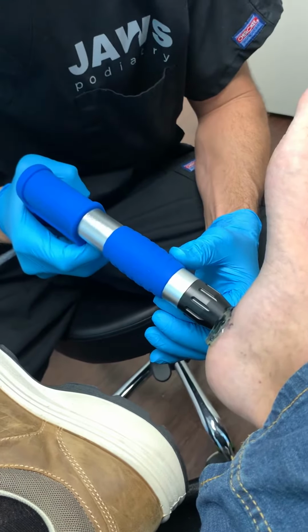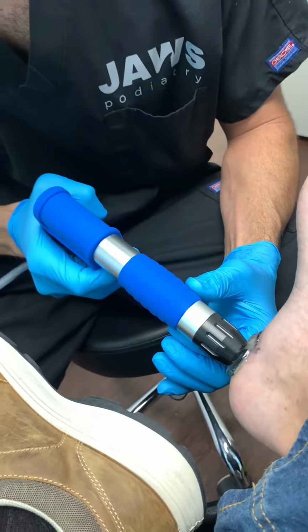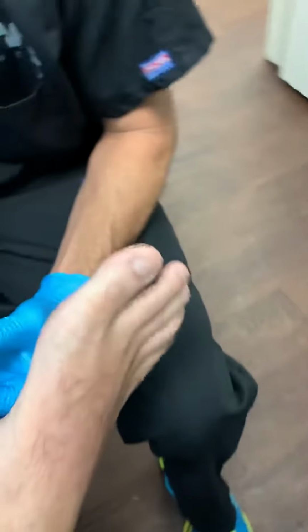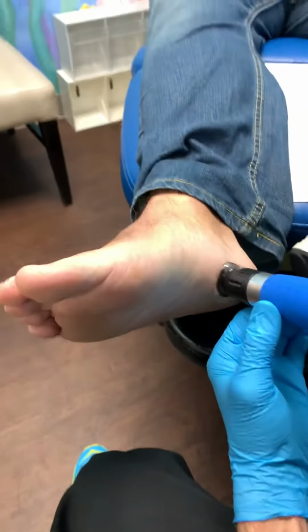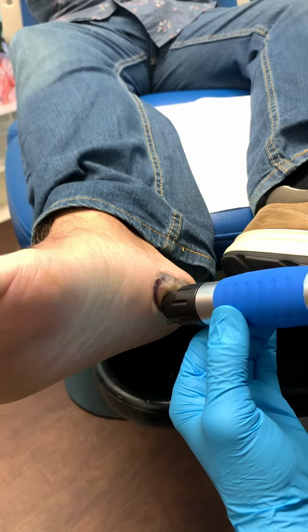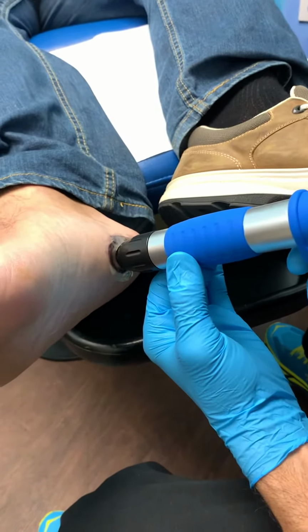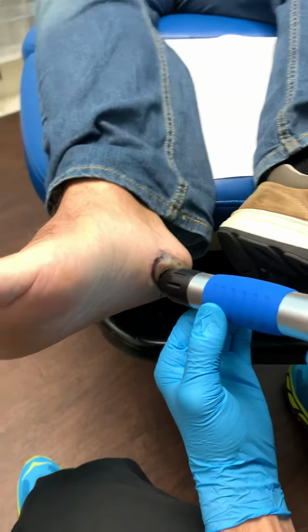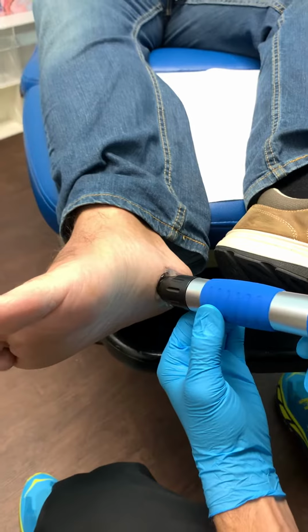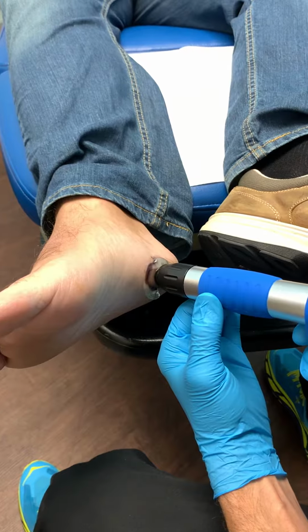How are you feeling? Good. So we'll start. You can come behind me, Aisha, I think it'll be better. We'll start with about 500 shocks at a lower level, and then we're going to beef up the power.